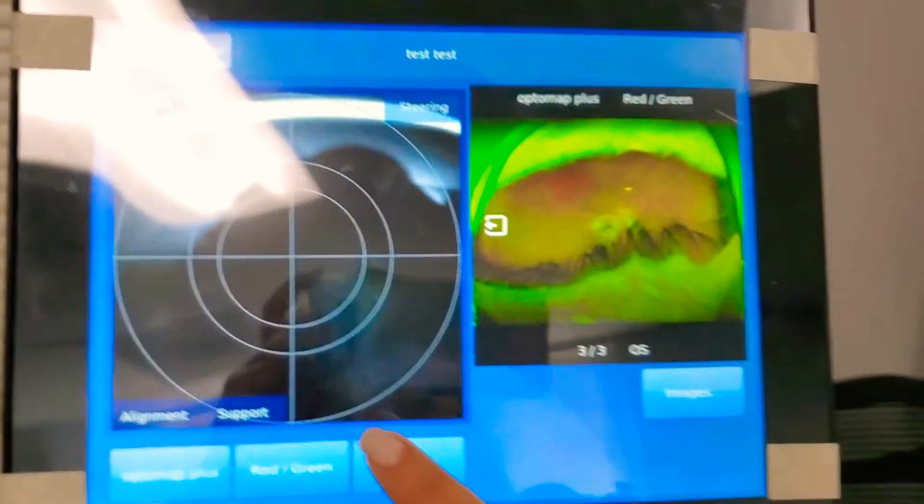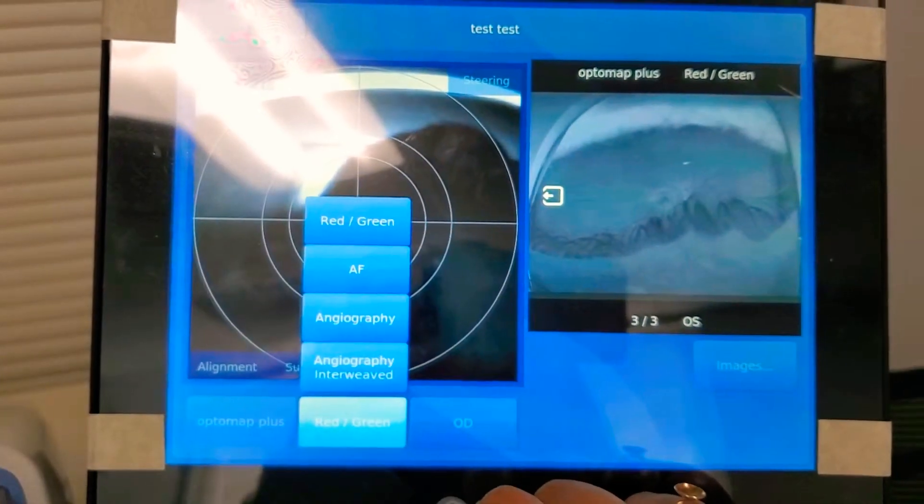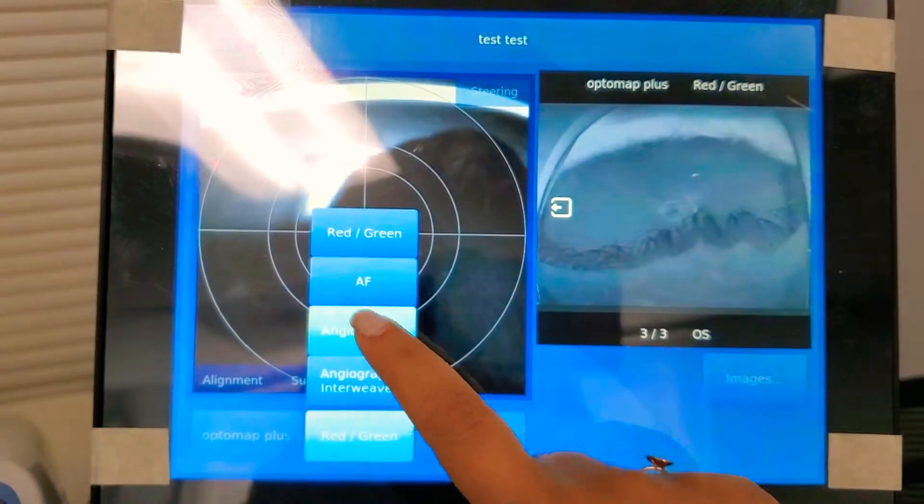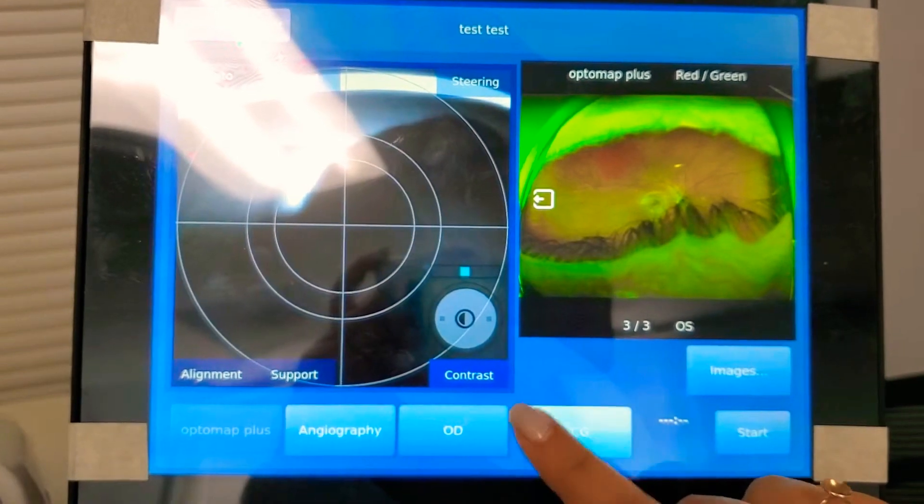All right. Close here. In order to take an FA photo, we're going to go here. Angiography. FA or ICG. We're going to do FA.